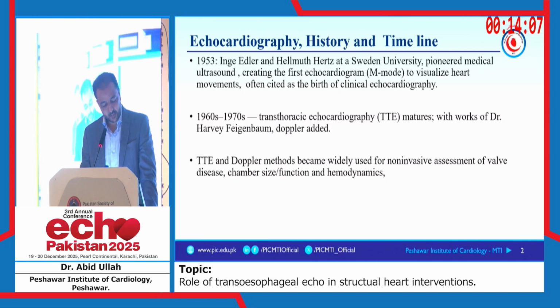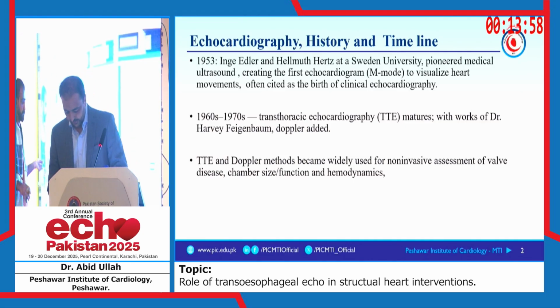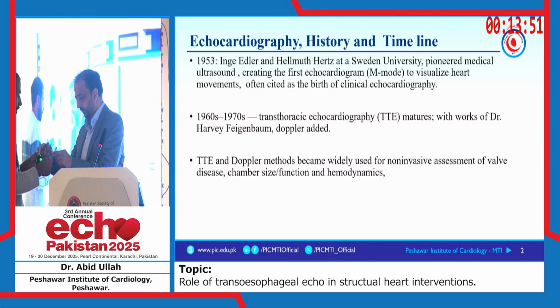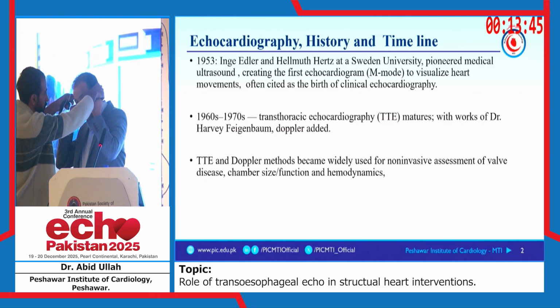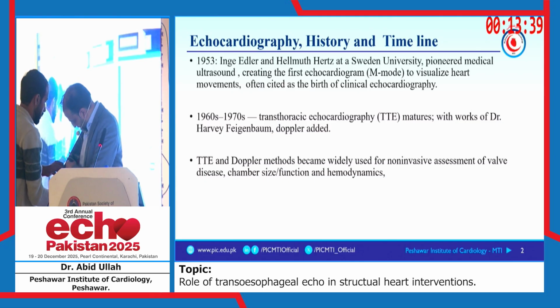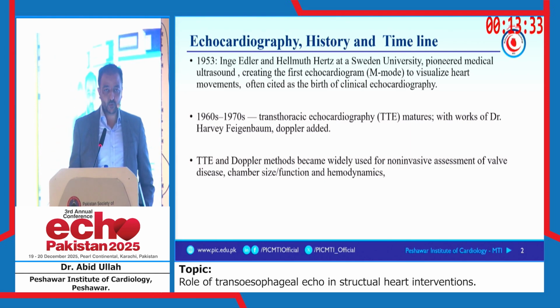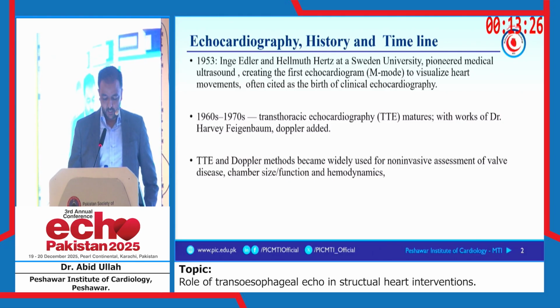And in those decades, the transthoracic echo and the Doppler, in the decade of the 1970s, was used much more in the assessment of valve disease, chamber sizes, and function.